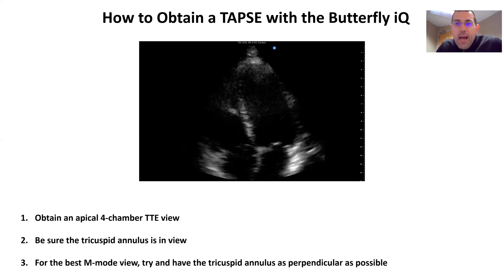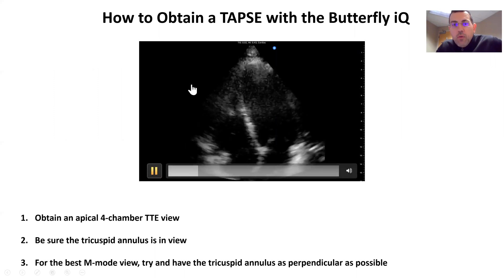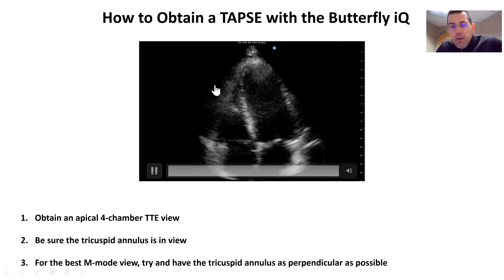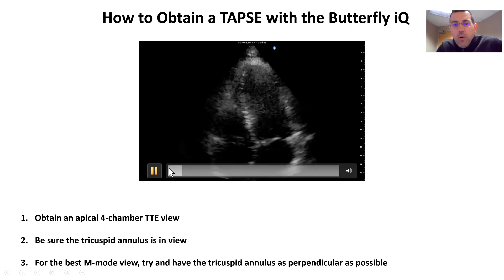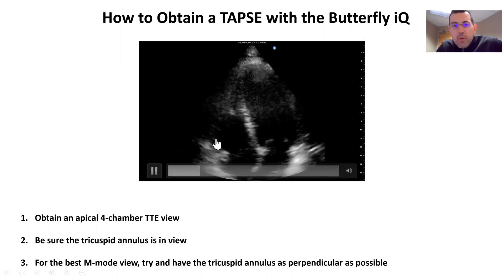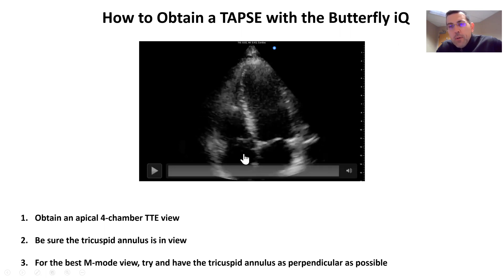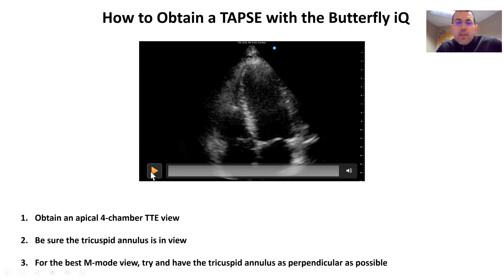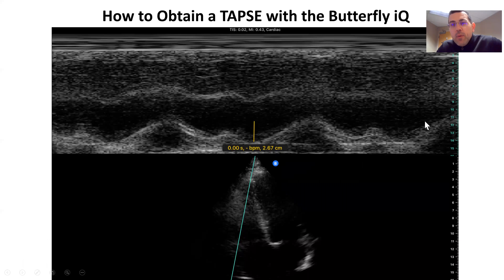So how do we obtain a TAPSE with the Butterfly? The first thing we're going to want to do is get our typical apical four-chamber view. Here we have an apical four-chamber view. What we want in particular is to have the tricuspid annulus right here, bouncing up and down, in view. In an ideal world, you'll have that lined up as perpendicular as possible, but what usually happens is that we get it at an angle of approximately 20 degrees or so, and that's just fine. We do need to have this tricuspid annulus in view.